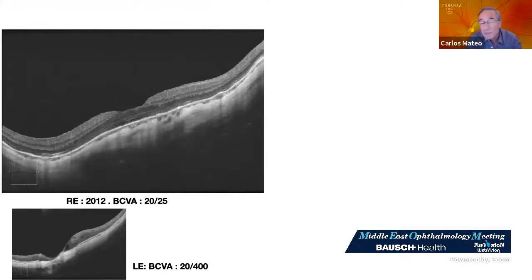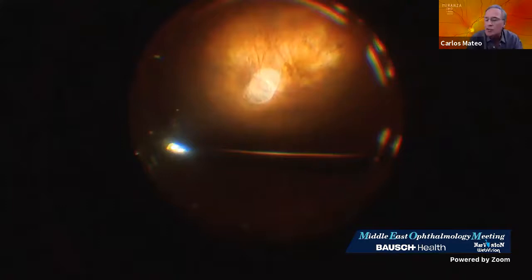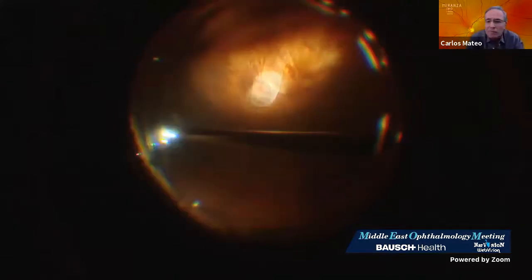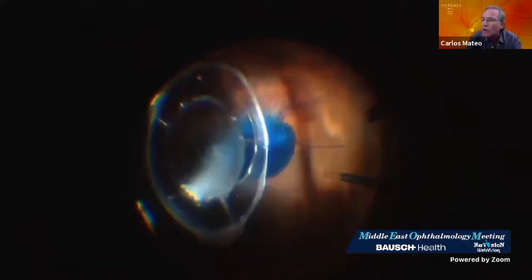But as a vitreoretinal surgeon, you have to be aware of this because imagine this patient has a high myopia and suddenly she developed a macular hole with decreased vision in her only eye. And then I started my vitrectomy. As you can see here, only peripheral vitrectomy. And then I went down, I stand and knock, knock, the lens fell down. Then you have to be used to managing this.